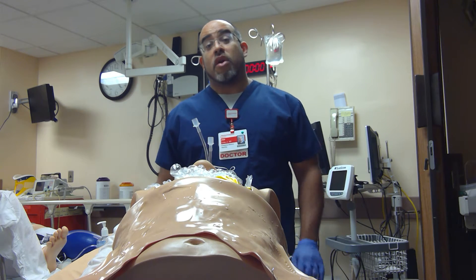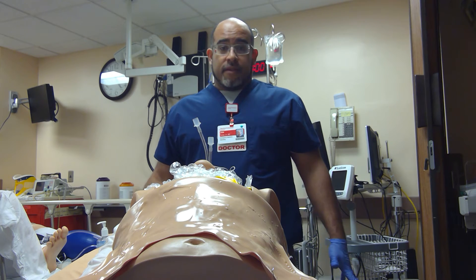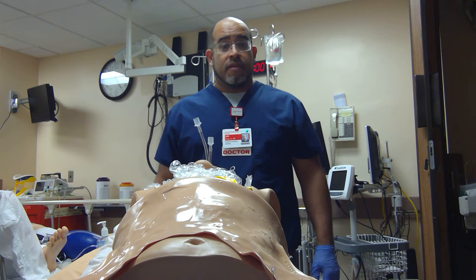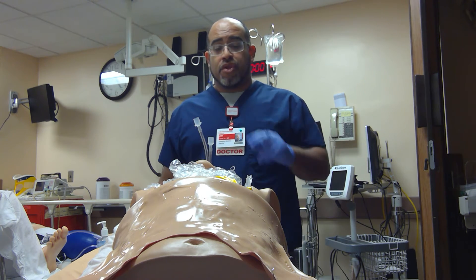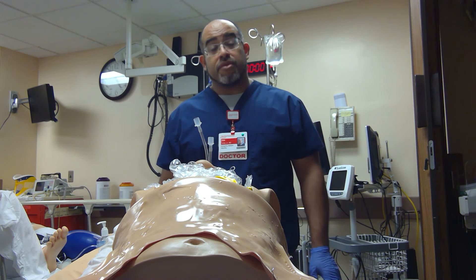This is hard. Regardless of what you're doing, this guy can die while you're doing this. This is hard. Maybe better off going to the trachea — the opening is slightly wider than negotiating the bougie through the glottic opening. Closer to the carina, maybe it's easier to direct the direction of your bougie.